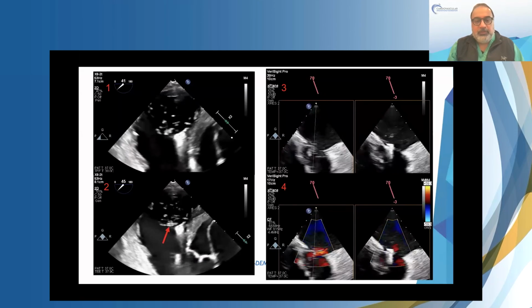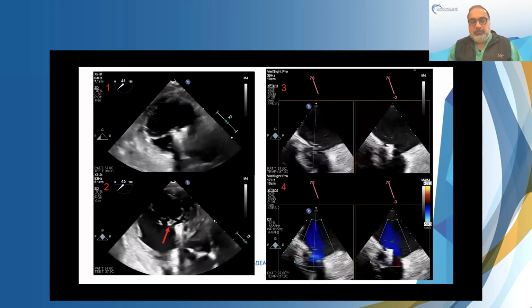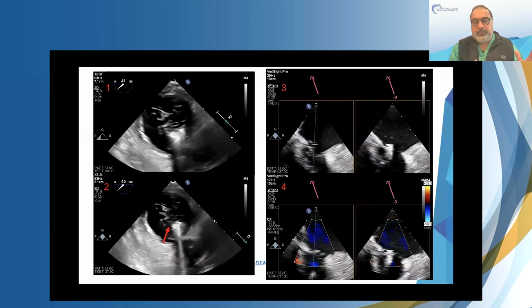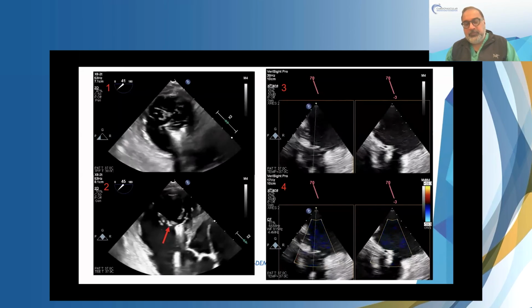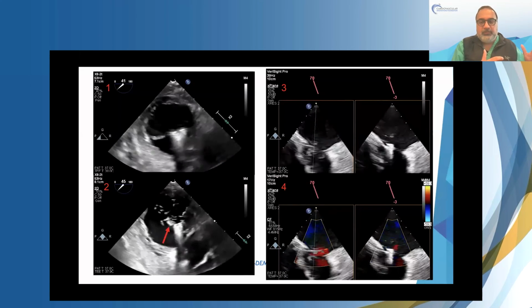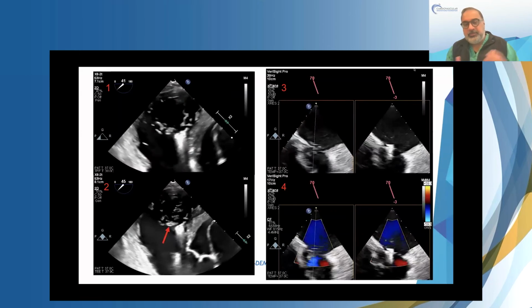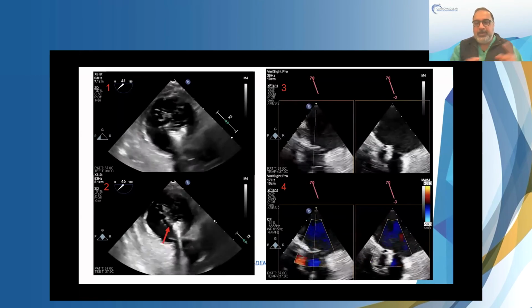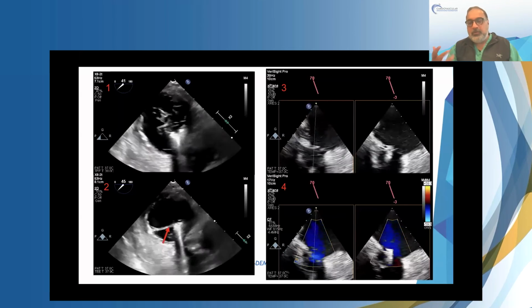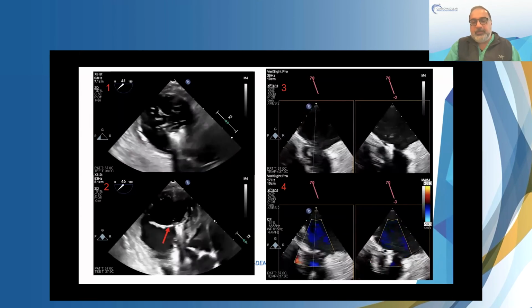your workflow. What we used to do is you'd start off mid-esophagus, and then you couldn't really see leaflet insertion. You weren't happy with it. Then you would go transgastric. You couldn't really see leaflet insertion, and then you would go back to mid-esophagus, and then you couldn't really see what you're doing. Then you would go back to transgastric. You just kept going back and forth, and 20 minutes go by, and in our world it's 20 minutes. So it was probably really only 5 minutes, but it felt like 20 minutes, and we hadn't made a decision.